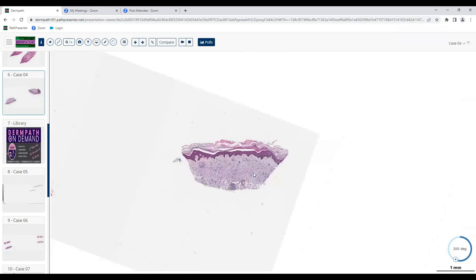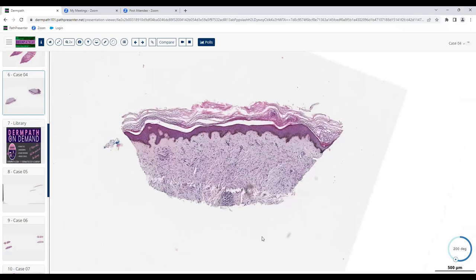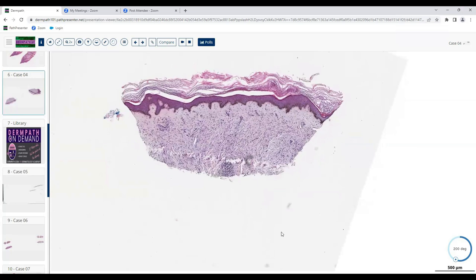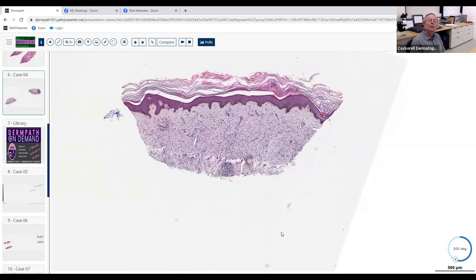Okay, I'm going to go into something a little different here. Starting from the top going down, the epidermis looks pretty unremarkable — some basal layer hyperpigmentation — but most of the action is in the dermis. Do you think it's inflammatory or neoplastic? I think it's more inflammatory. What pattern of inflammation are we looking at? It has a distinctive pattern.